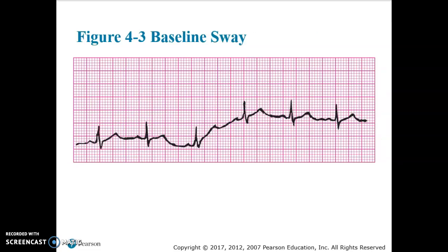Baseline sway. With baseline sway, the baseline moves up and down. So that isoelectric line here, you can see is kind of traveling up and down. It is caused by a breathing pattern, and you may see this if a patient has a lot of lotion on their skin. So you want to wipe off any lotion, any sweat, and make sure that you're getting these pads stuck down to dry skin. Baseline sway is not a problem as long as waves and complexes are clear. So you could actually turn that strip in to the doc. It's not going to be a problem.